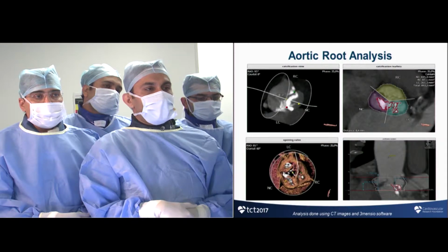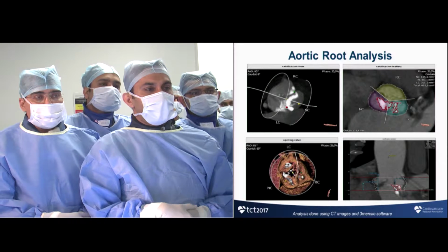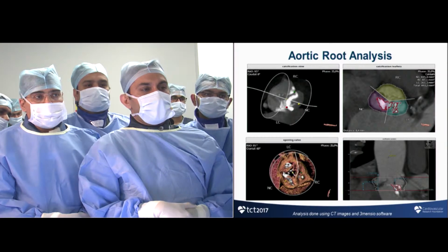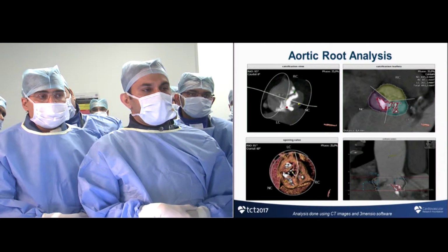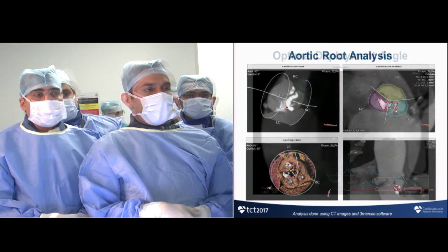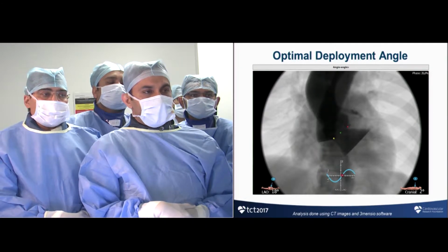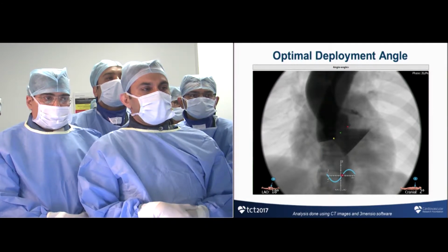Here we are looking at the calcification. Most of the calcification is at the leaflet, but there is some calcification even in the LV outflow tract. As you can see, a chunk of calcium beneath the left coronary sinus. This is the CT scan derived deployment angles to determine a coplanar view.